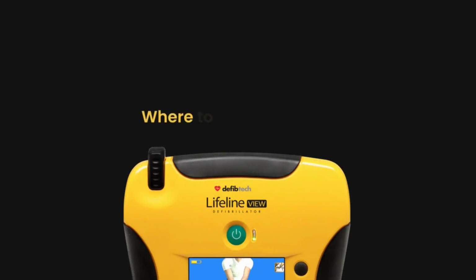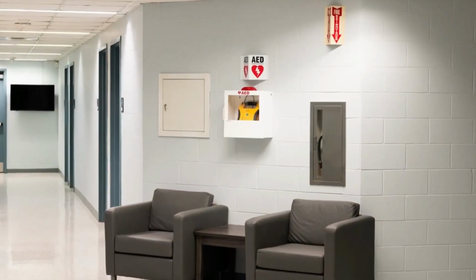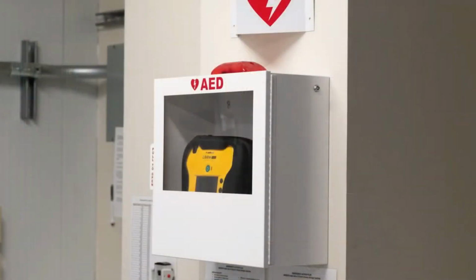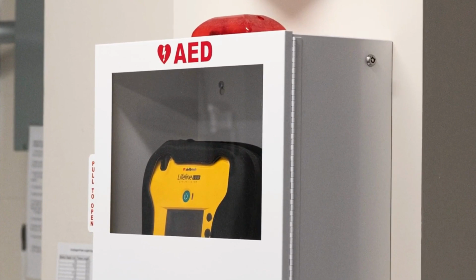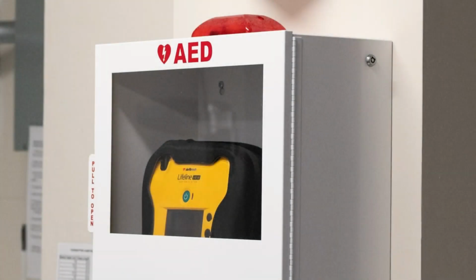Next, we have to decide where is the AED going to go. The first and most important thing is that the AED is always accessible. We have a couple options of where we want to put it. The first is inside a building on the wall. If we want to do this, you can use an alarmed wall cabinet. It is important to remember the wall cabinet should never be locked. You should always have the active status indicator light facing out so you can always check the status of the AED.